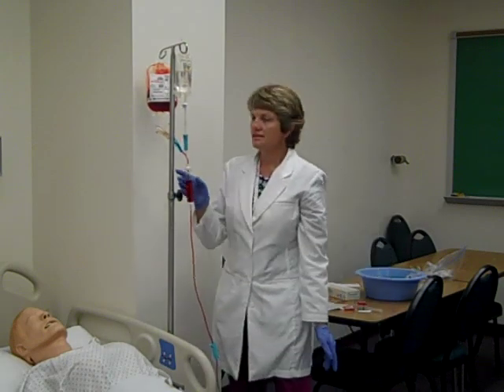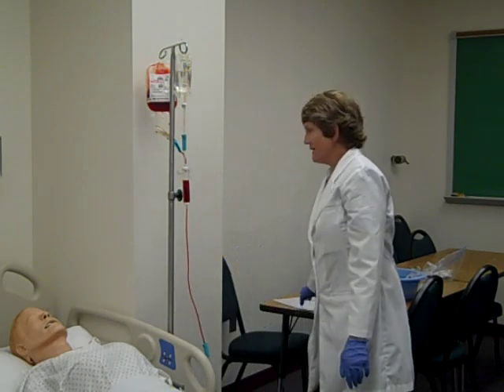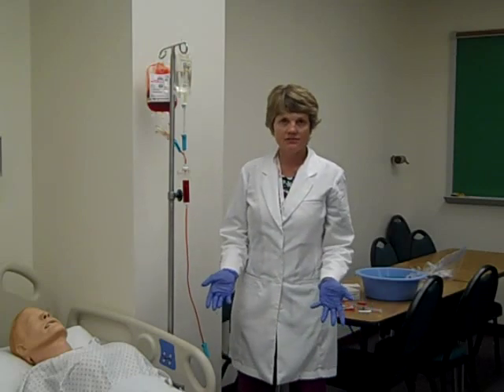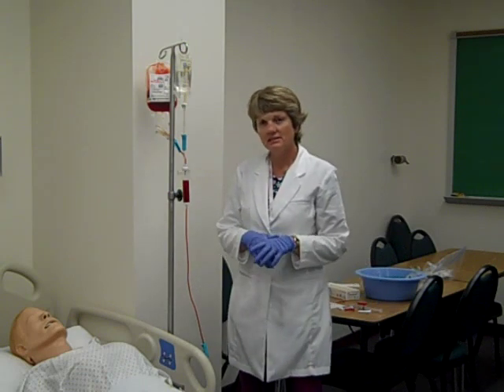Alrighty, so I got that, and it's running at 75 milliliters an hour for the first 15 minutes. I've documented my vital signs. I'm going to stay in the room with the patient. I'm going to observe them for any adverse reactions. This is where I can grab the patient's chart. I can start documenting on the bedside chart.